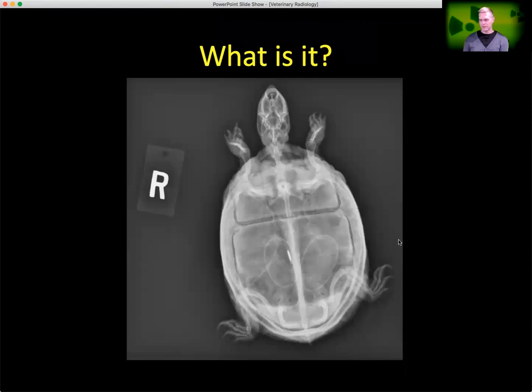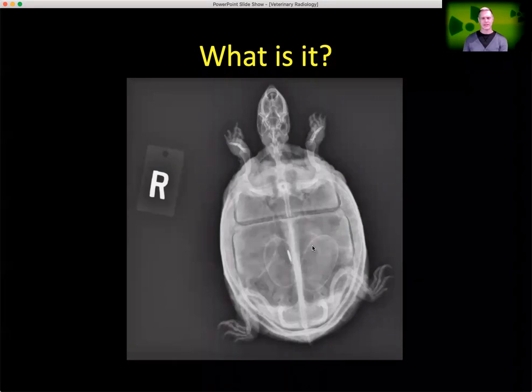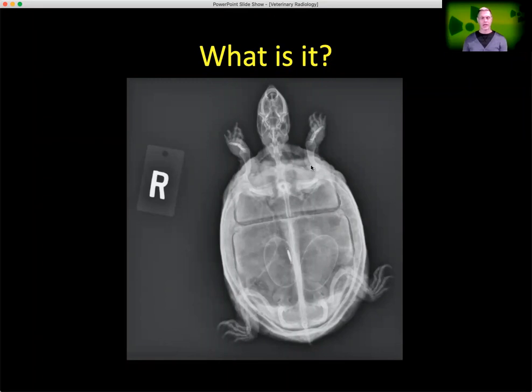Oh, another quickie. This should be fairly easy. We've got obviously a turtle, and is it a girl or a boy turtle is the question. Yes, indeed. We've got 2 eggs in this turtle, we can see. Turtles are a little challenging to radiograph because there's obviously a lot of mineral in their shell that surrounds them, but we are often looking for eggs within them, and thankfully, most of the time they have a mineralized shell so we can see them. This right here, this very metal thing, is actually a microchip. So this was a part of a collection where they microchipped their animals to identify them. And so we can see that also very clearly.